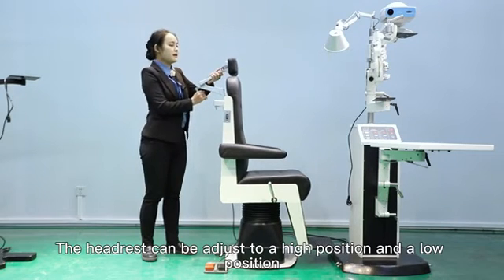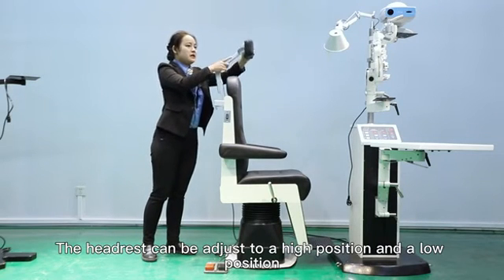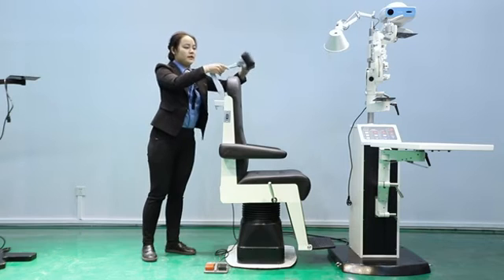The headrest can be moved and adjusted to a high position or low position. Very flexible.